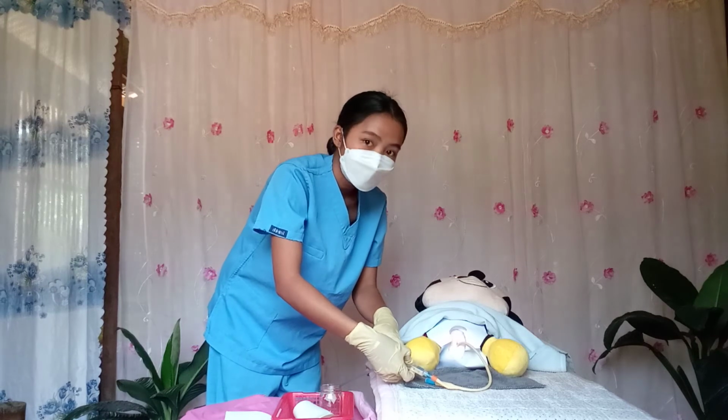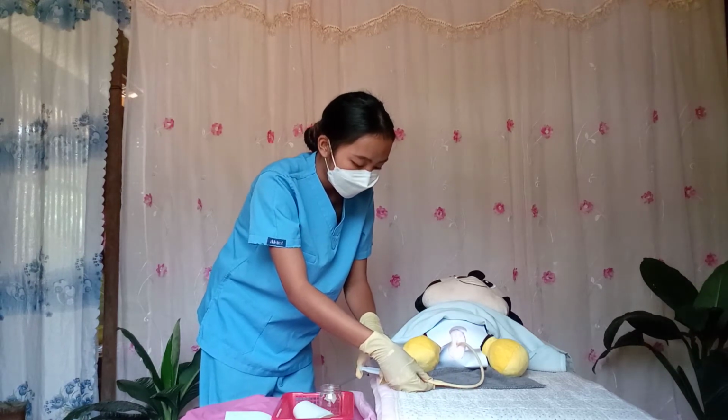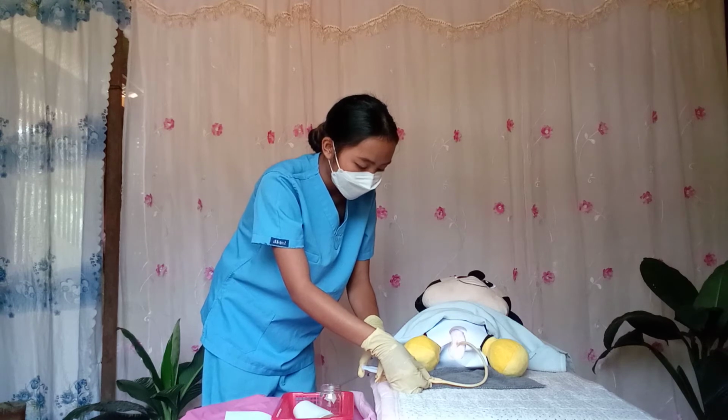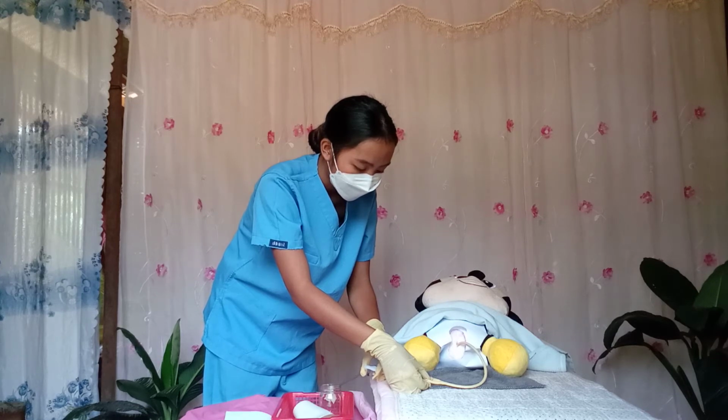Inflate the balloon with 10 cc of water. So the balloon will prevent the catheter from slipping out of the body.